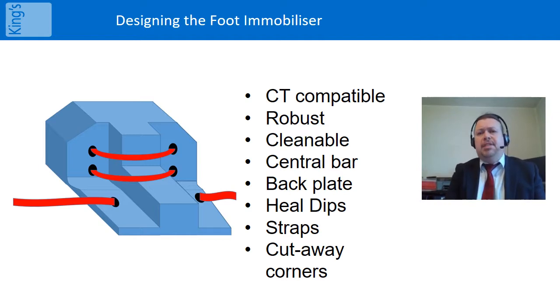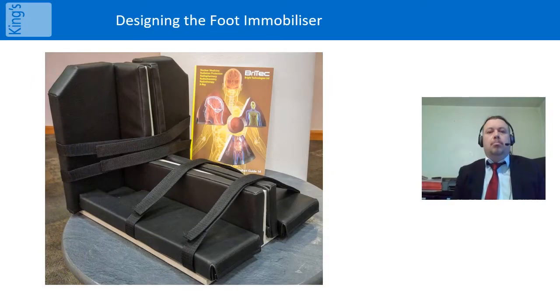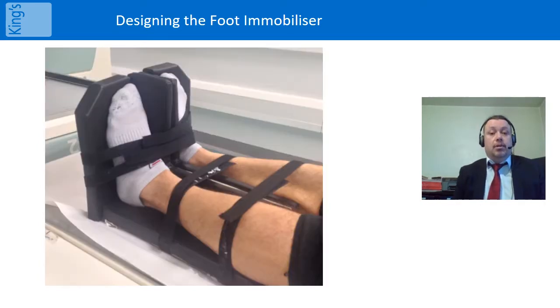The device needs to be CT compatible as well as cleanable. Cutaway corners allow the gamma camera to come in close during the SPECT orbit. Bright Technologies Ltd took our specifications and built a prototype device for us. Here you can see it in use. Note how it replicates the position recommended for CT imaging of the feet.